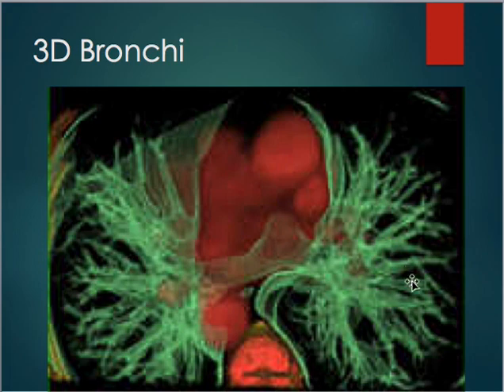This is a 3D CT of the bronchi in the lungs. You can see all the branching of the different bronchioles. These are great for small cancers like bronchoalveolar carcinoma. They're really hard to pick up because they're very small little cancers inside of there.